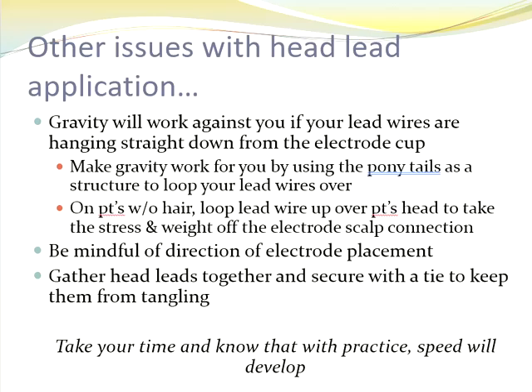And then we're going to gather them all together and secure them with either what's called a posy or a tie, or you can tie them together with a gauze pad, because it helps them stay straight, it helps them from pulling, and it helps the patient from getting tangled in them. It's a lot easier for the patient to move around with the wires securely bundled together. The other thing too is the wires in and of themselves, if you think of each one as an antenna, when you bundle them together, it keeps them together so they're less likely to be picking up a lot more of the ambient electrical activity in the room.